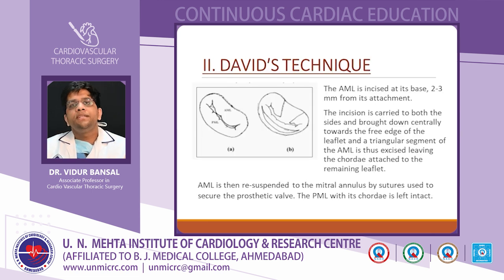Then came David's technique. So, in this technique, the AML is incised at its base 2 to 3 mm from its attachment. So, as can be seen in this diagram, the incision is carried to both the sides and brought down centrally towards the free edge of the leaflet, such that a triangular segment of the AML is thus excised, leaving the chordae attached to the remaining part of the leaflet. So, the remaining part of the AML is then resuspended to the mitral valve annulus by sutures used to secure the prosthetic valve. The PML with its chordae is left intact in this technique.